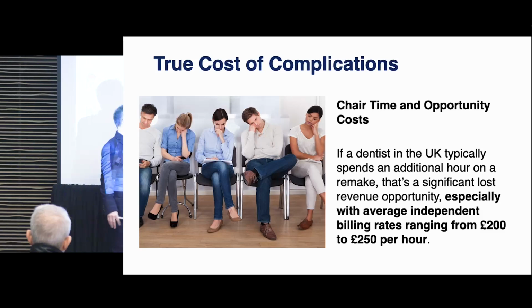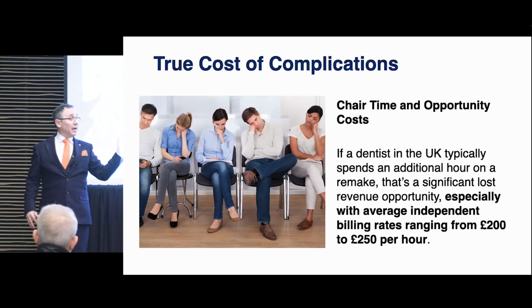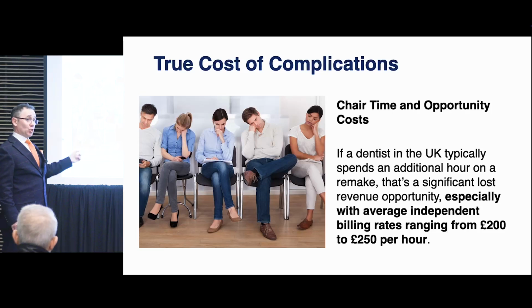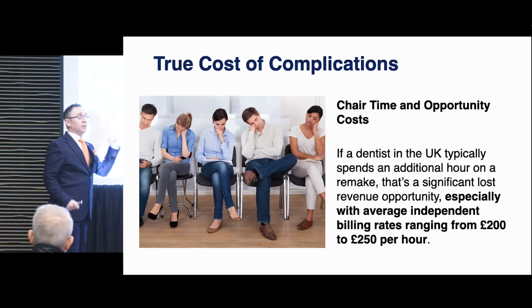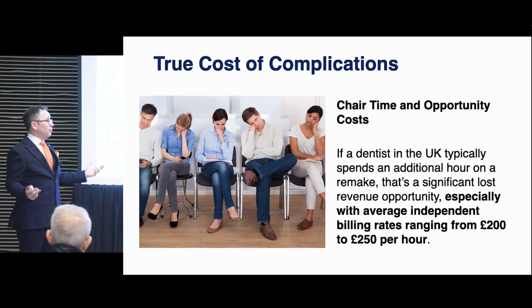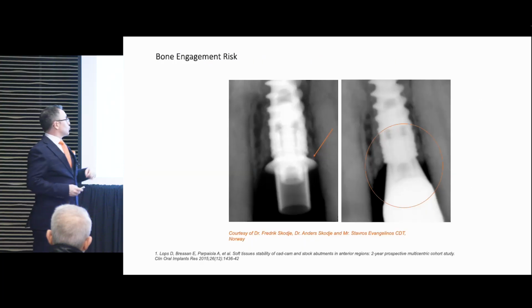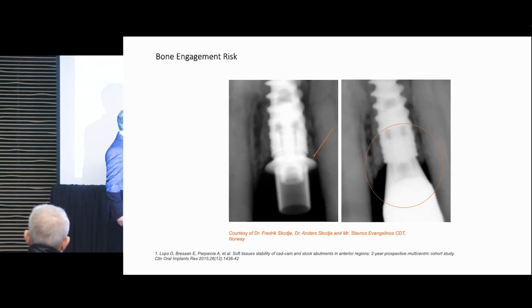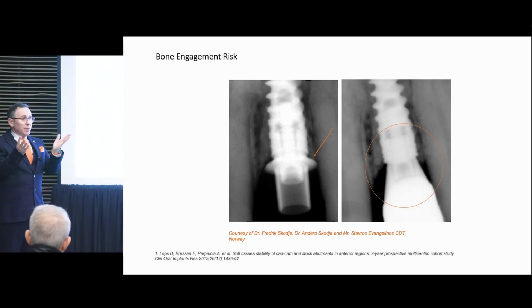And now these are conservative. I saw Antti Benkovsky recently. He's putting up more towards £500 or £600 an hour is what he optimally needs his surgeries to be running at. So if somebody comes back in with a fractured crown, what's that, 20 minutes off, rescan, back to us? That's your valuable time. So we're really doing this for a long-term philosophy. And I've always done this because Martin covered it. It's the avoiding bone engagement.